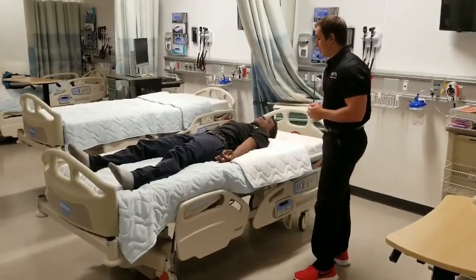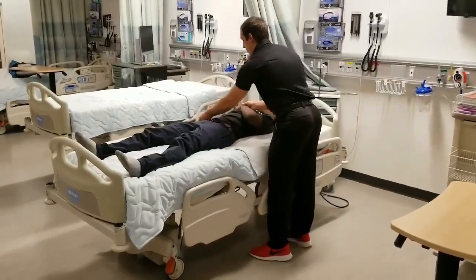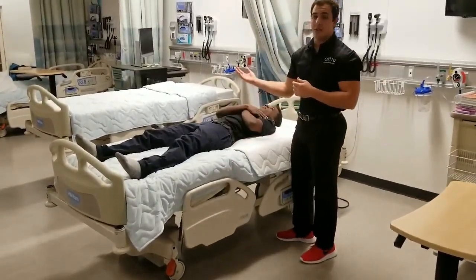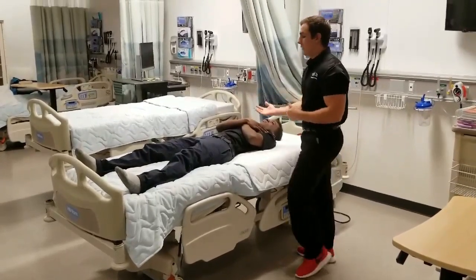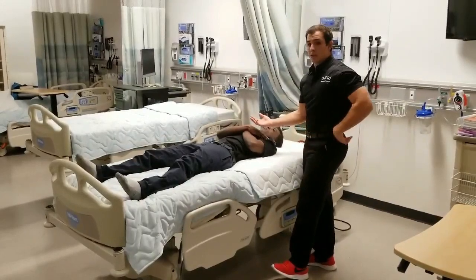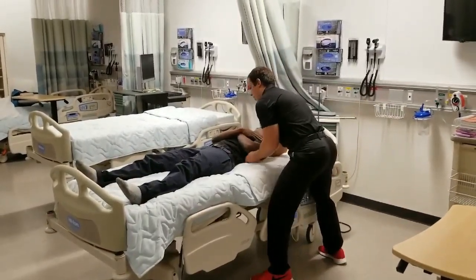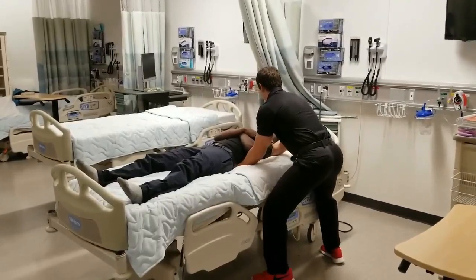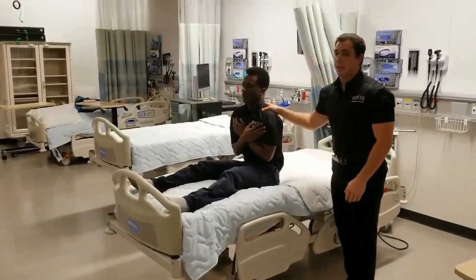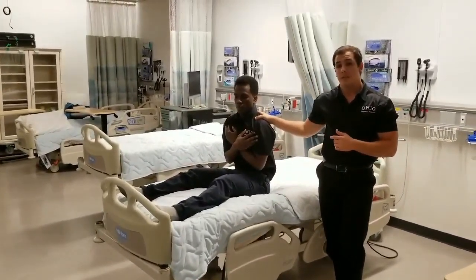All right, good. So what you want to do first is cross the patient's arms across their chest. You want to then place one arm behind the patient at the level of the shoulder blades, and then one at the level of the mid-back. You want to lift with your knees so you're not putting extra strain on your low back. I'm going to lift you at the count of 3, okay? 3, 2, 1. Maintain one-hand contact on the patient at all times, since this can be an unstable position for the patient.